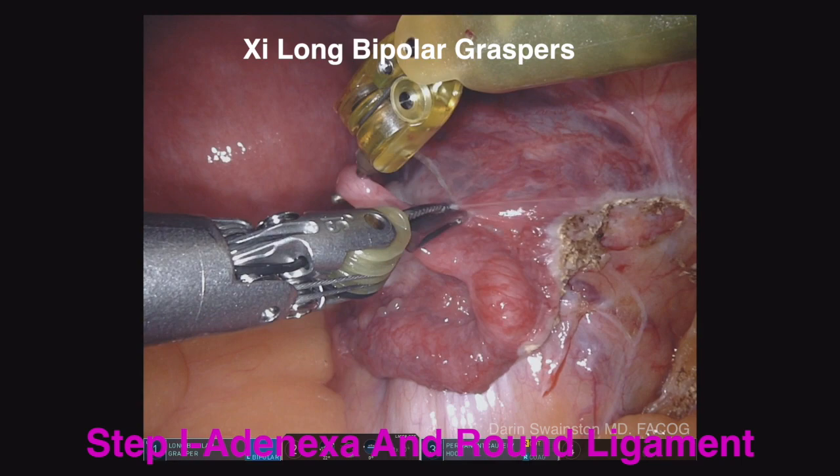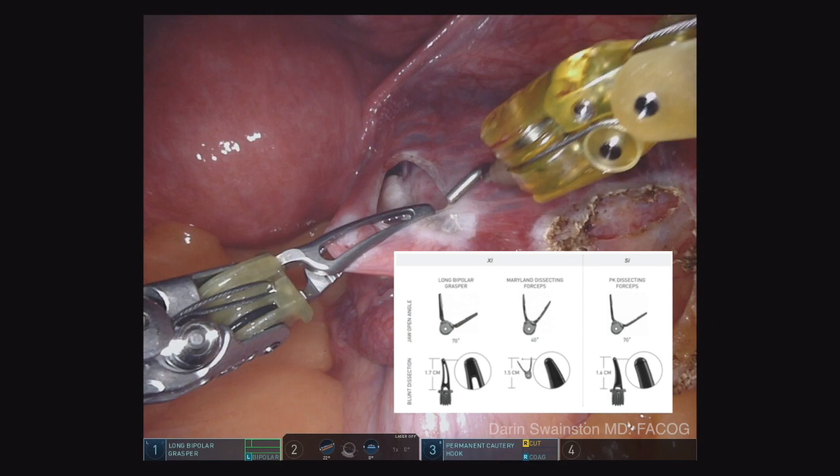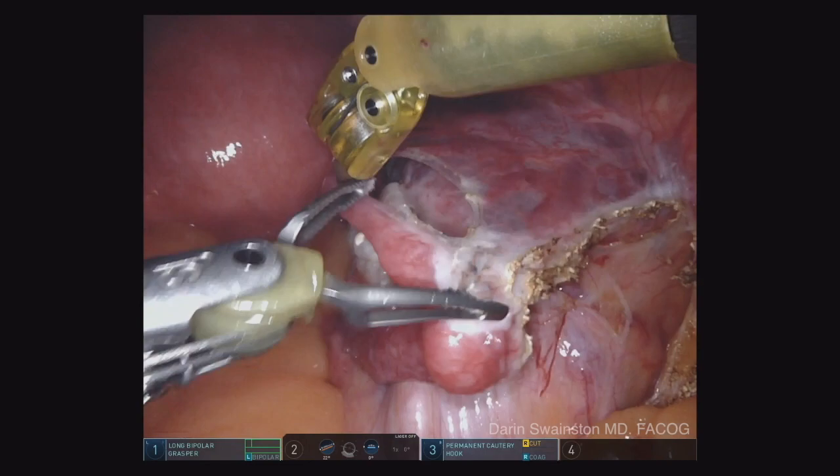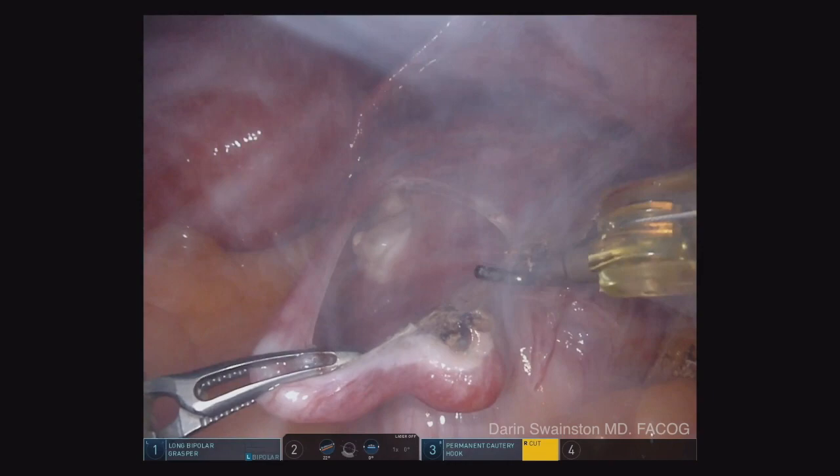This is a bipolar grasper — a large, new instrument from XI that incorporates all the qualities of both the PK and the Maryland. It's longer, stronger, has more teeth, has a better rounder tip for dissecting, and it's got more tensile strength. I think you'll really like it.